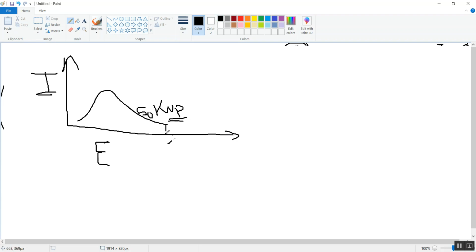If we represent the kV energy from 0, 20, 50, up to 120 kilo electron volt, this is the energy of the X-ray produced. This is for 50 kVp, so the end value here will be at 50 kVp.